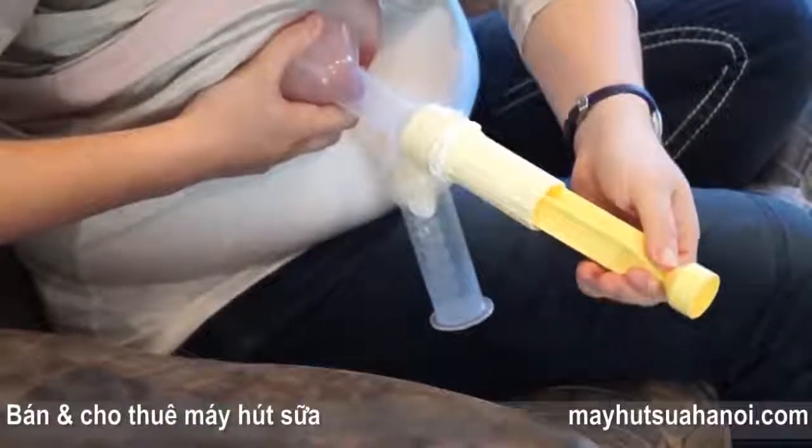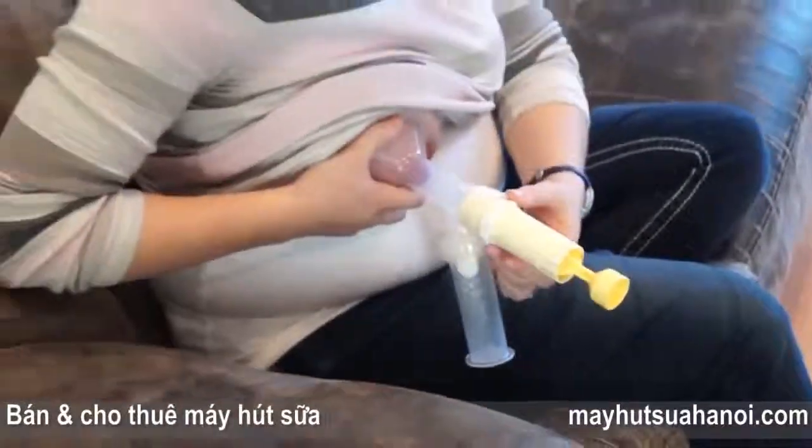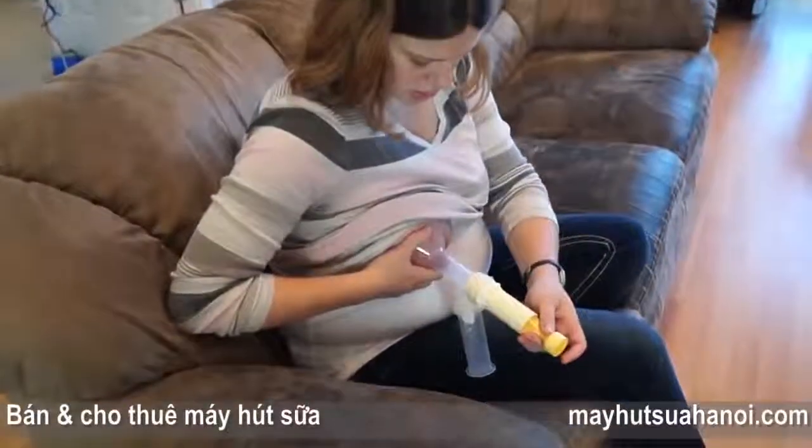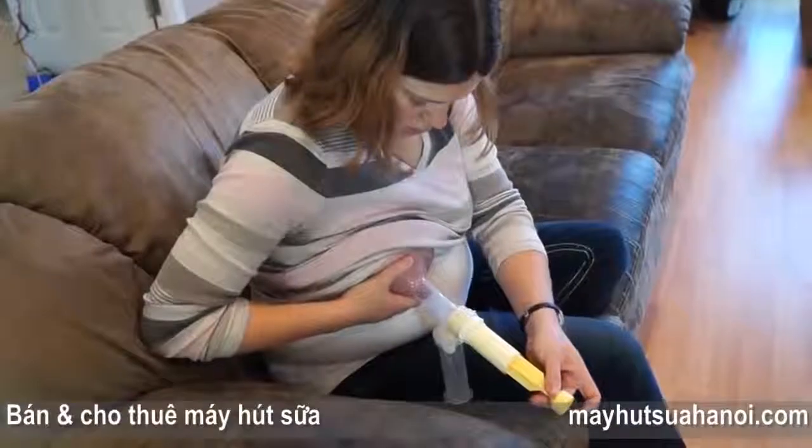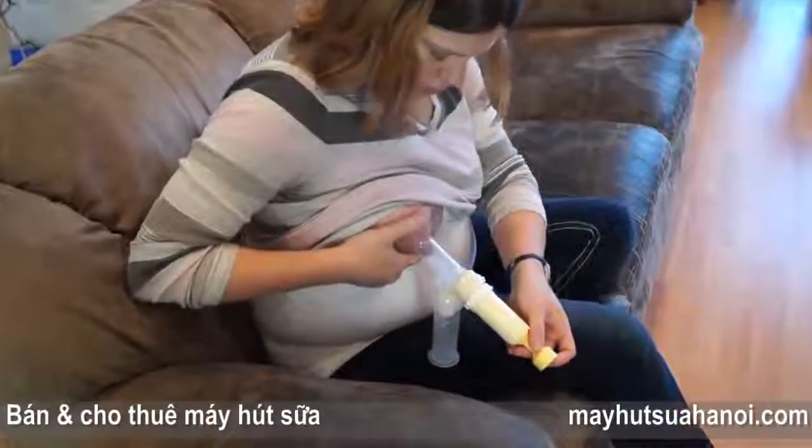And then when milk starts to flow, you can do longer, slower movements, just like the baby would when he's nursing. If you feel like there's not enough suction, this particular pump, you can adjust the suction. You don't want to do it so hard that it hurts, but you do need to get the milk out. And there it goes.